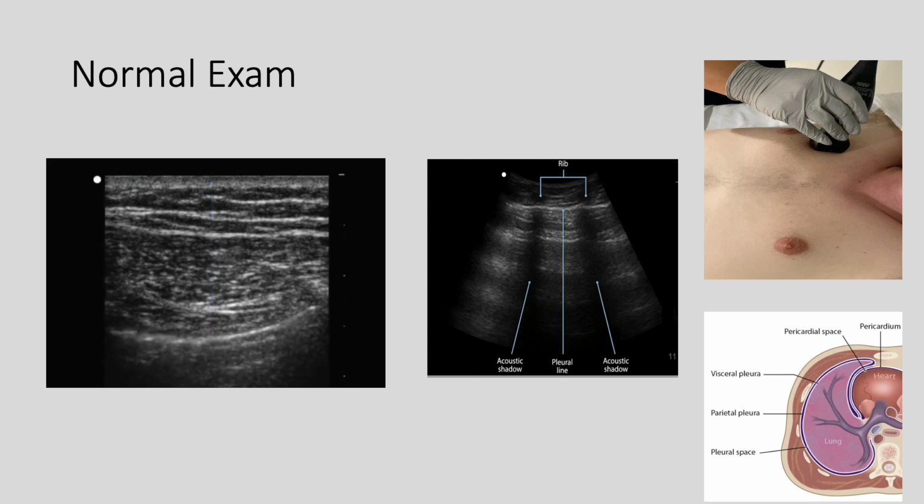When performing an EFAST exam, attempt to identify the sliding lung sign at that location and then move the transducer inferiorly along the anterior chest. Ideally, one will scan along the entirety of the anterior thoracic cavity and be able to document lung sliding at each point, supporting the absence of a pneumothorax.